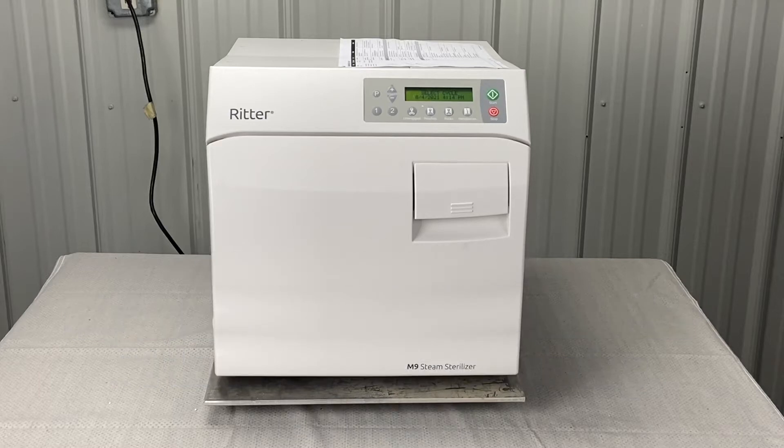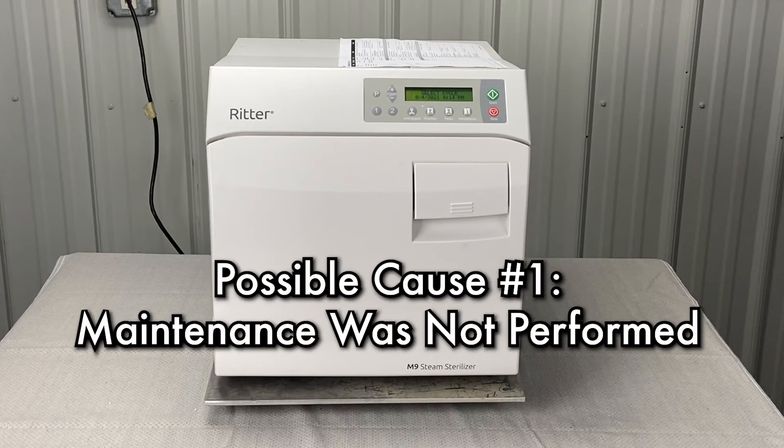Number one, we're going to want to do our maintenance if it has not been performed — cleaning of filters, draining of water, and among other things. Refer to the video on weekly and monthly maintenance.